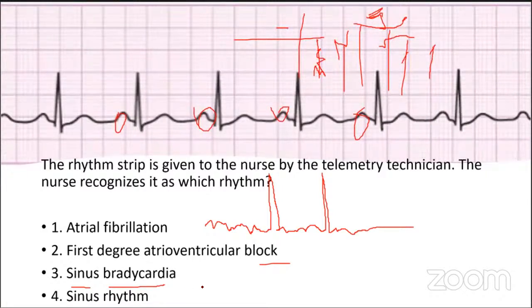Could this be a sinus rhythm? Obviously, I see P waves. For every P wave, I see a QRS complex. For every P wave, there's a QRS complex. That's one feature of a normal sinus rhythm.